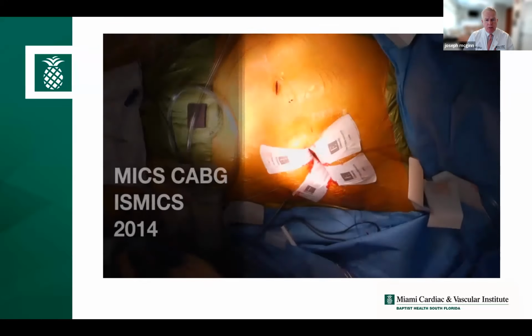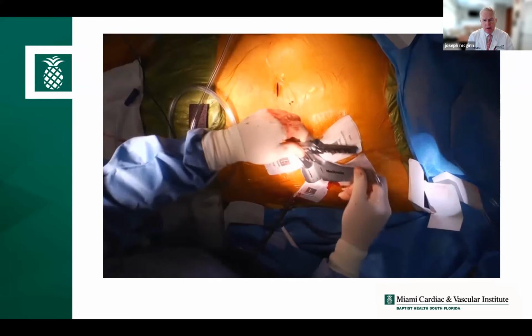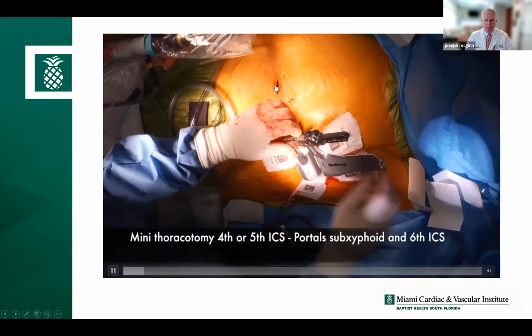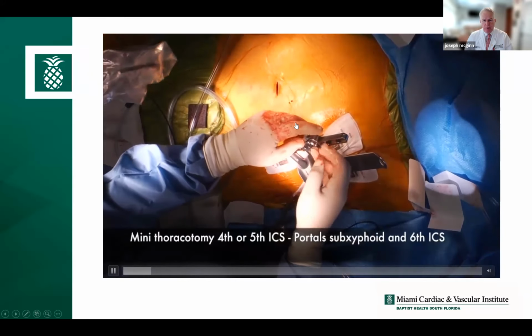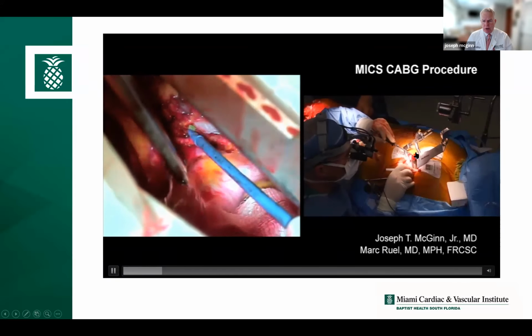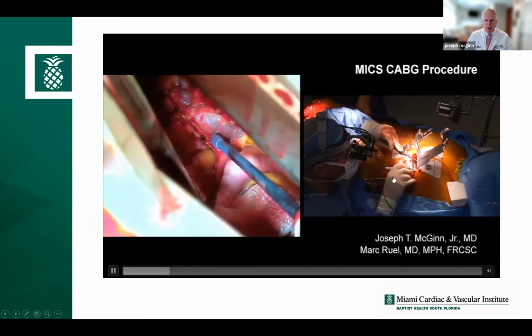This is a video clip of a presentation I made in 2014 at one of the major conferences. I just want to show you how the surgery is done. It may be a little gory, so you might want to squint your eyes closed if it gets to that point. But you'll see there are three main incisions. There's one under the xiphoid here. There's the main incision through which you see me working. It's a little slit. And then there's a third incision, which you can't see here.